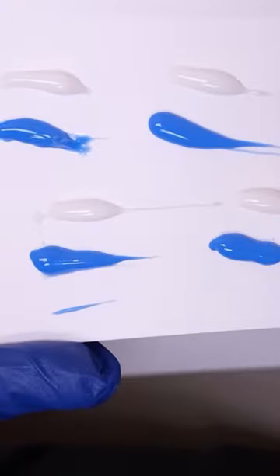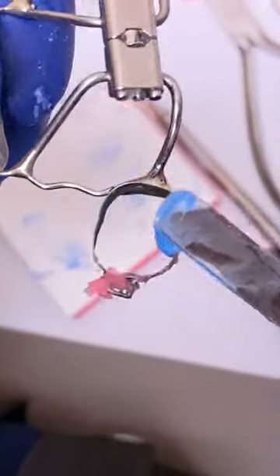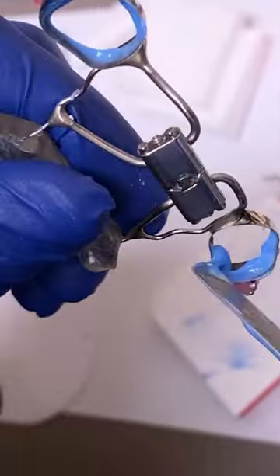We'll cement them on with Fuji glue. Sometimes you can feel a little bit sore when these appliances are put on, so just make sure you take some ibuprofen and Tylenol before, and then also invest in a water flosser.